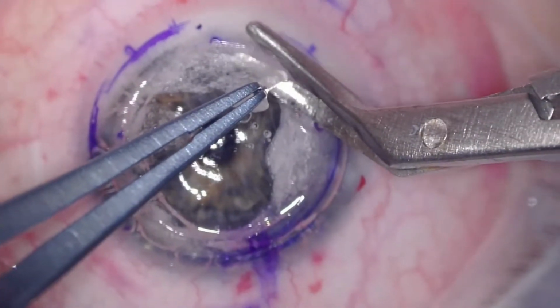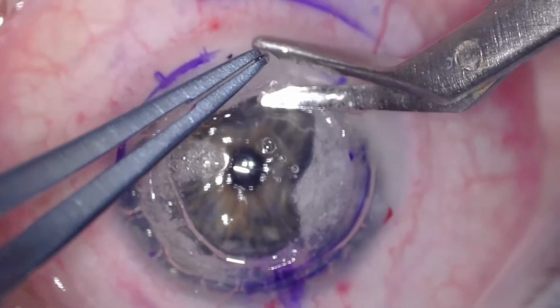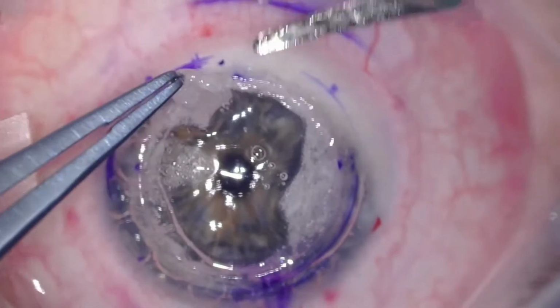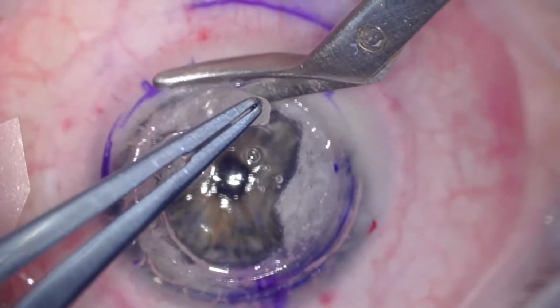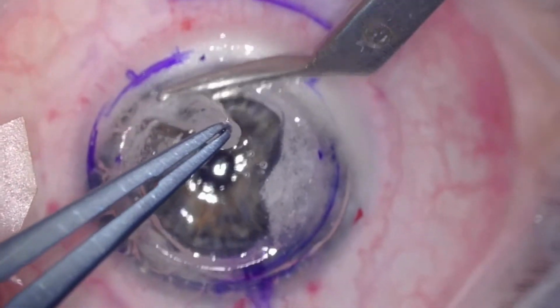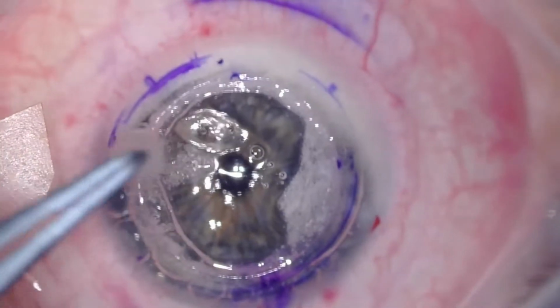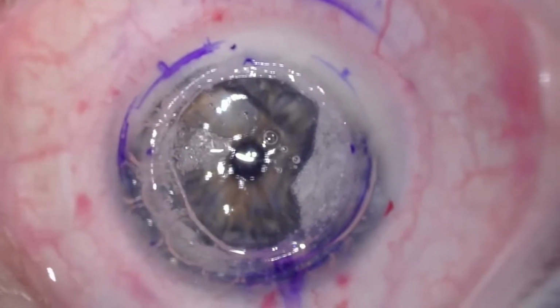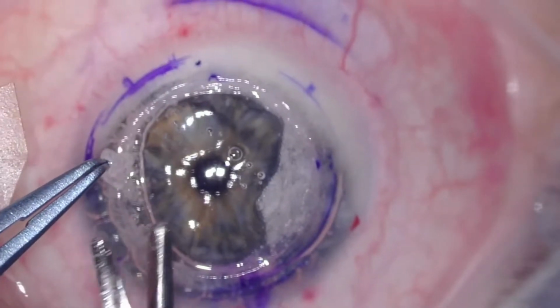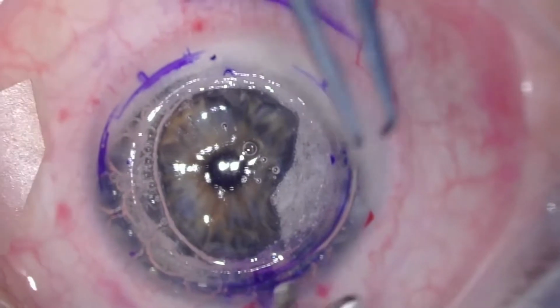And you can see the DALK scissors are very blunt on the bottom half. They're almost rounded, so they don't create any risk of dragging or catching of the Descemet's membrane underneath. This is helped by the fact that there is viscoelastic, allowing the scissors to glide over the Descemet's. I'm trying to make the opening as clear as possible and as free from any stromal fibers as possible, so I'm just cutting the residual stroma here.